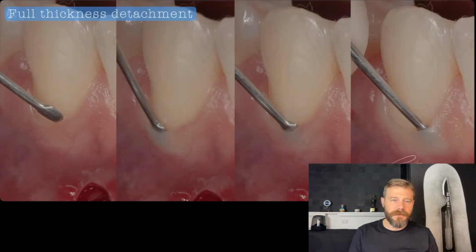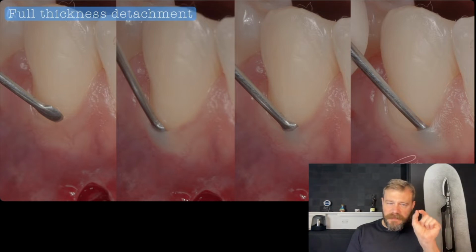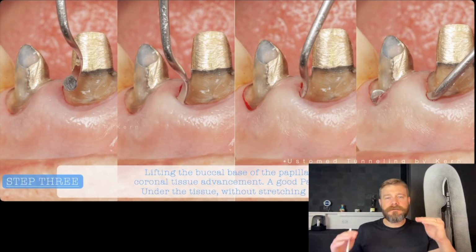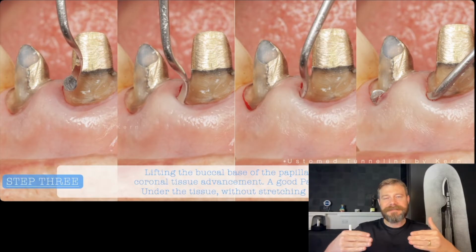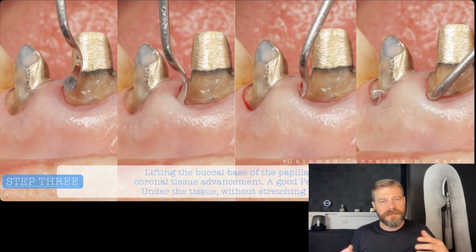In different circumstances, it's going to be the same approach. This is just the step done with this delicate instrument in the sulcular area, and one important point here: we're not yet detaching the tissue from the bone in the step that I showed you. We're just working on the sulcular area, okay?